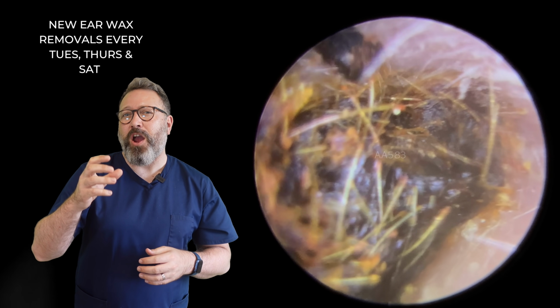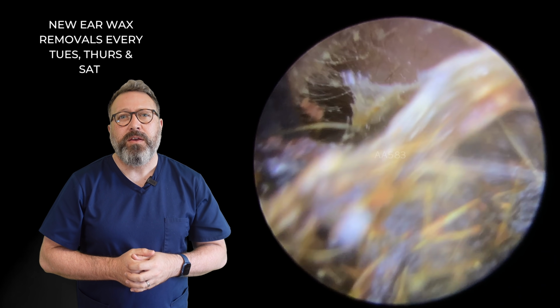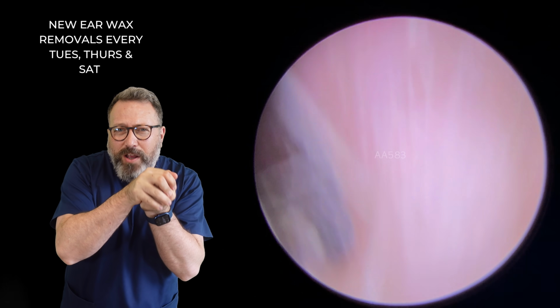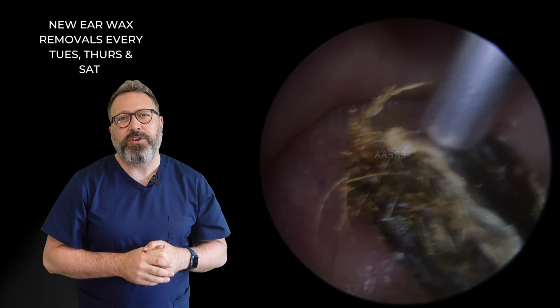You can see very, very dark, very dried out, very solid piece of wax, this one. A lot of dry skin underneath. You can see those little white lines over the top of the wax, and that's the dry skin that this wax has really been holding on to here. So I'm just going to lift up so you can get a good look at this.